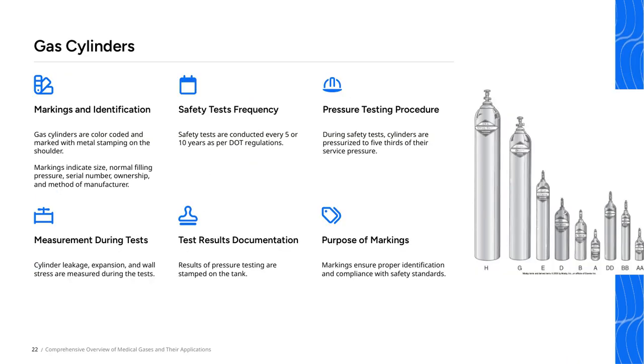Let's talk about the importance of markings on gas cylinders. These markings are crucial because they help us ensure proper identification and compliance with safety standards.